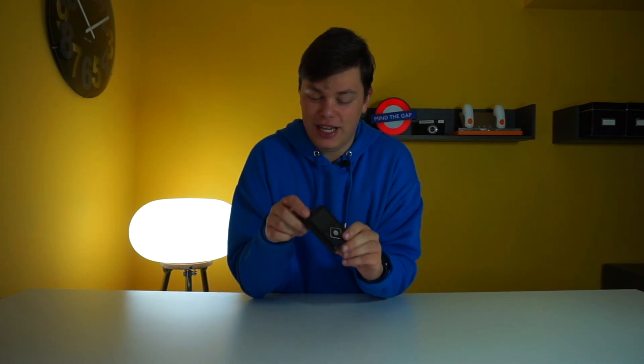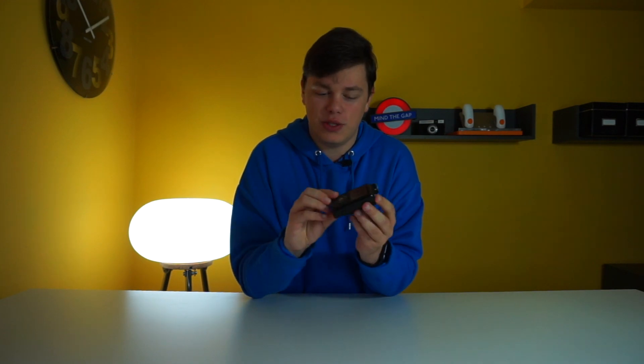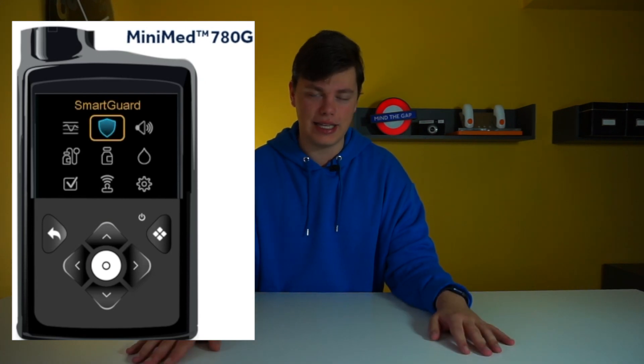The 780G has the same design as the older Medtronic pumps. This is actually my old 640G, but they look identical, so I'm just using this for demo purposes. The only physical difference is the button, which now has four squares. So on the outside it looks exactly the same, but on the inside it is completely different — it has Bluetooth.